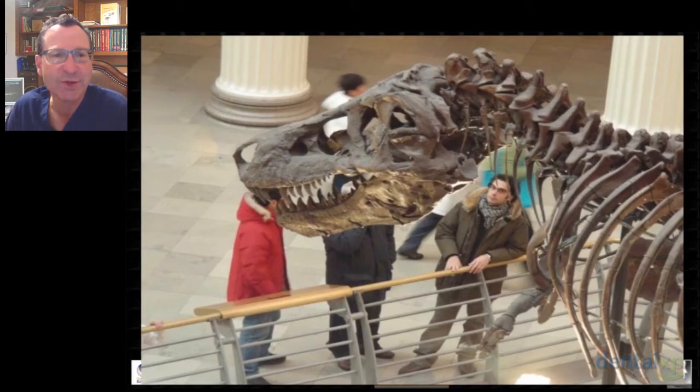The other thing is that two-dimensional imaging by itself can be very deceiving, and this is a good example of how two-dimensional imaging, non-radiographic, shows us this point. So here's three guys at the museum. They look like they're probably friends. They're all wearing coats. They must have all come in from the cold together to look at some dinosaur bones.